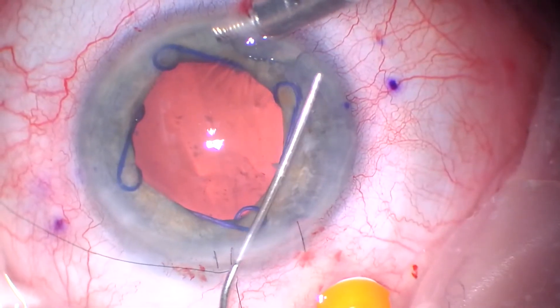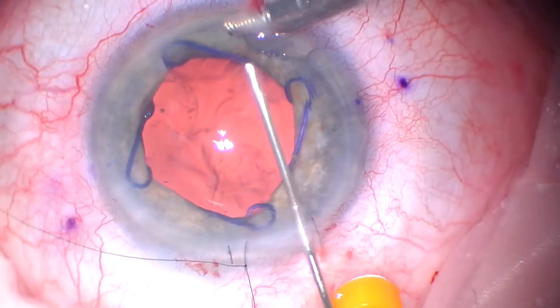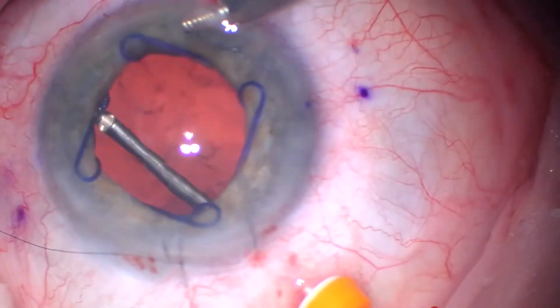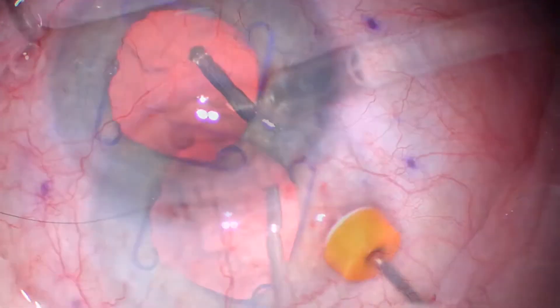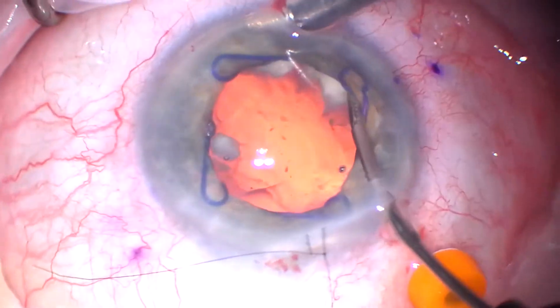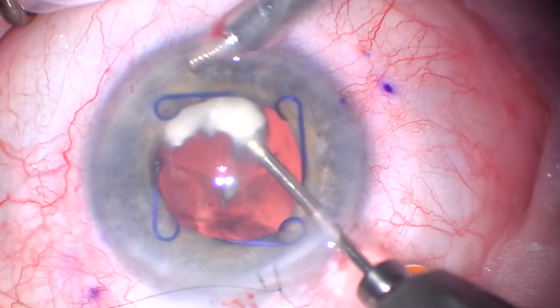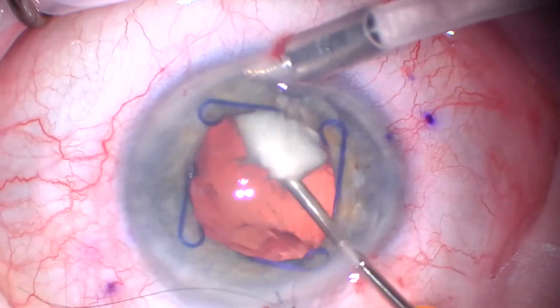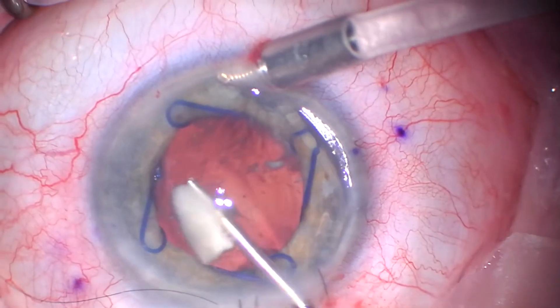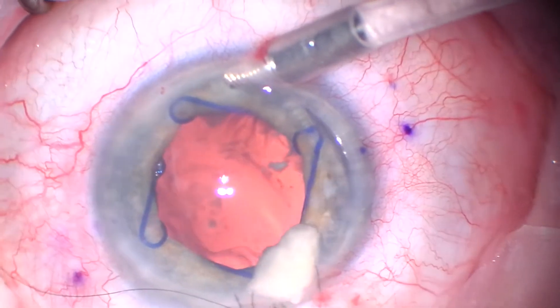Using the iris shelf to put some Viscote — if you just go in and squirt Viscote right in the middle, it'll fall straight into the vitreous cavity. But if you start on the edge of the iris, it'll fill the anterior chamber. Basically anytime I burp lens material out, I put a little more Viscote in and do a little more vitrectomy, just to make sure I'm not yanking on vitreous. I'm slowly putting it in the anterior chamber on the iris shelf and teasing it, then burping it out — little by little it slowly comes.